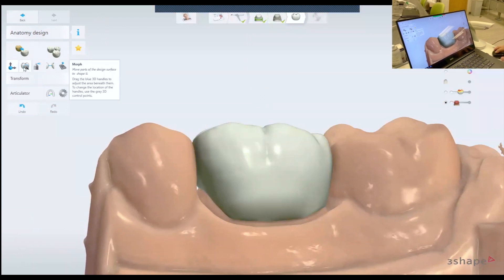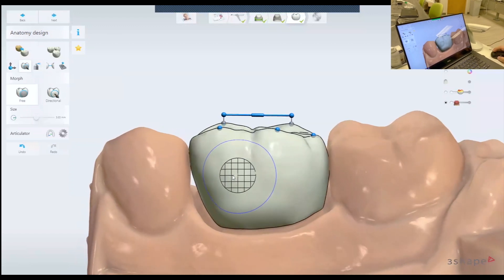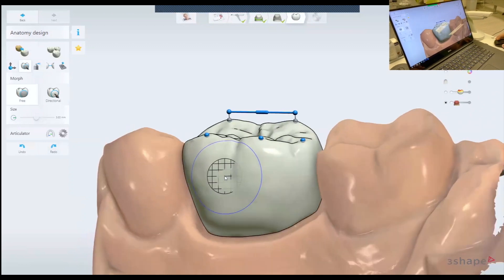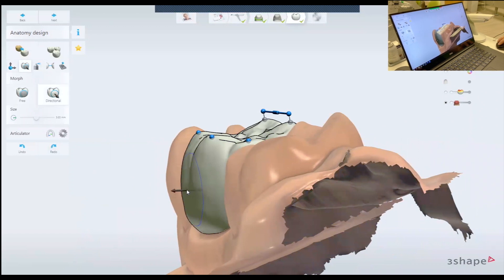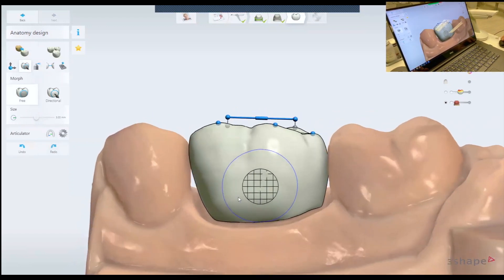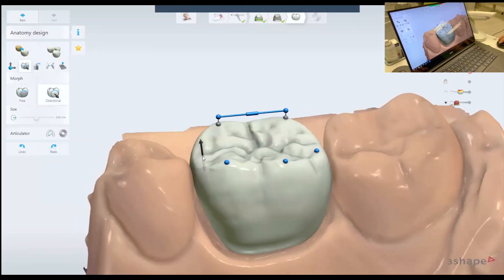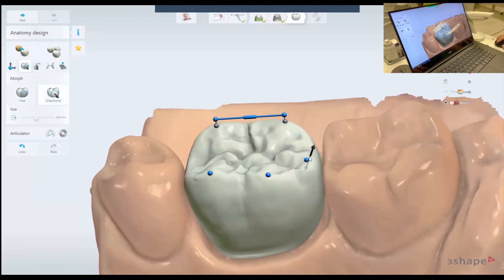The next tool is the morph tool. This tool is like a sculpting tool, but it just moves parts of the crown. I use this if I'm looking from the side — if you click Control, you see the free and the directional options. I usually use this tool to decrease or level the marginal ridge like that.